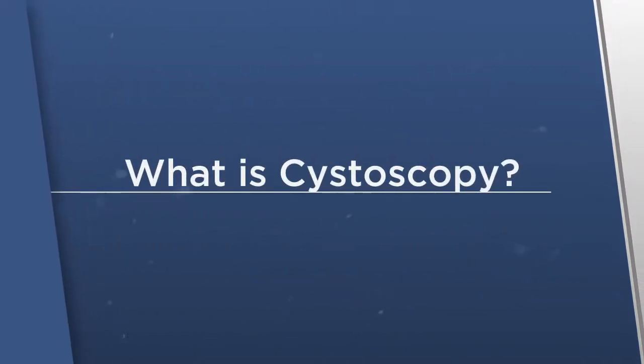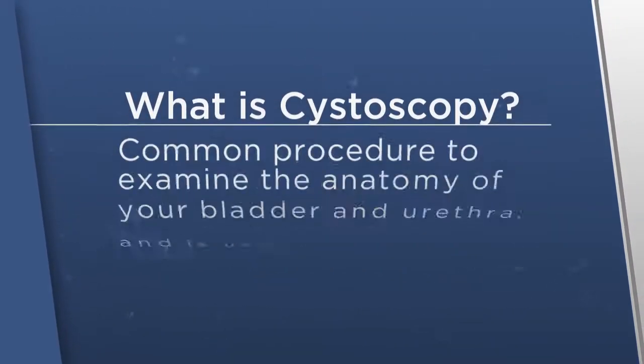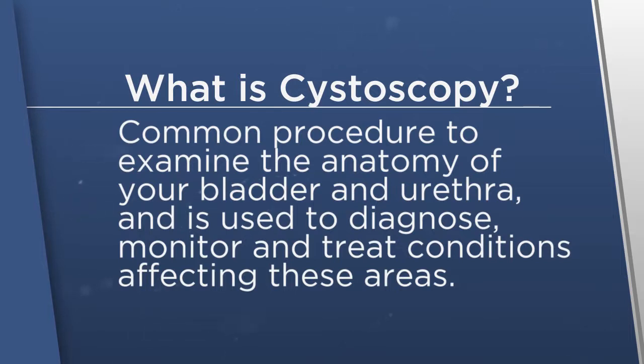What is cystoscopy? Cystoscopy is a common procedure that allows your physician to examine the anatomy of your bladder and urethra and is used to diagnose, monitor, and treat conditions affecting these areas.